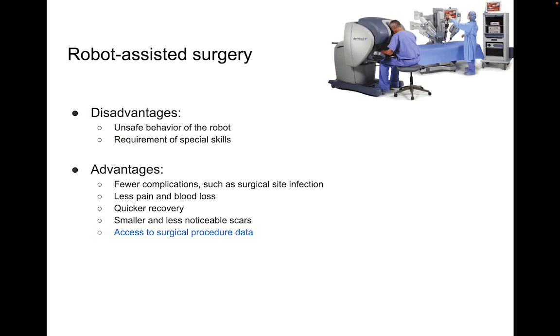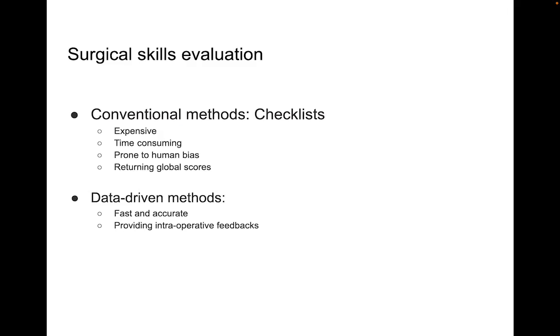However, it has several advantages, including fewer complications, such as surgical site infections, less pain and blood loss, quicker recovery, smaller and less noticeable scars, and above all, access to surgical procedure data. An important point here is that a surgeon must acquire a sufficient amount of skills before operating on real patients.